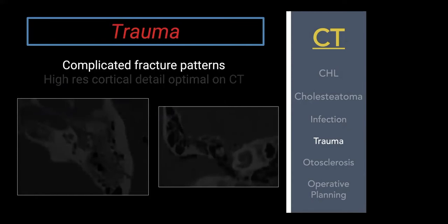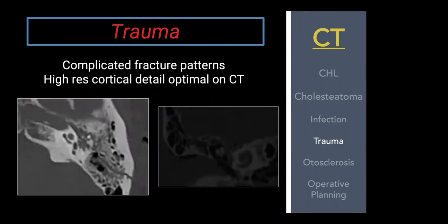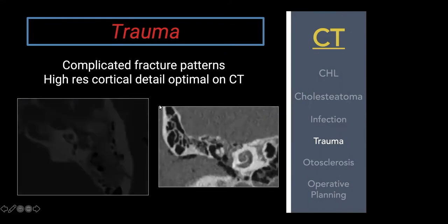Trauma is self-explanatory for CT — fracture patterns are often complicated, and the high-resolution cortical detail that CT provides is optimal. On the left, you can see a fracture breaking through the mastoid cortex propagating into the middle ear, with too much space between the malleus and incus — a malleoincudal disassociation. The same finding is seen on a coronal CT: patchy fluid and an abnormally wide malleoincudal joint, indicating another traumatic disassociation.